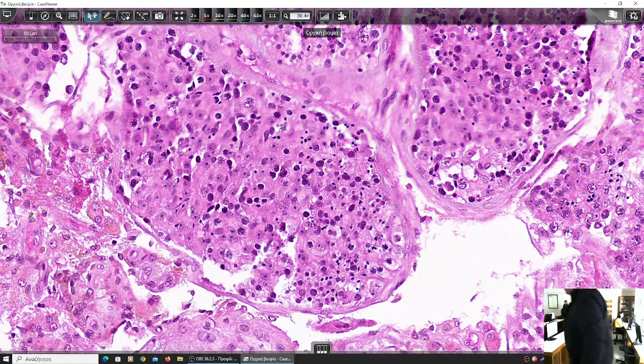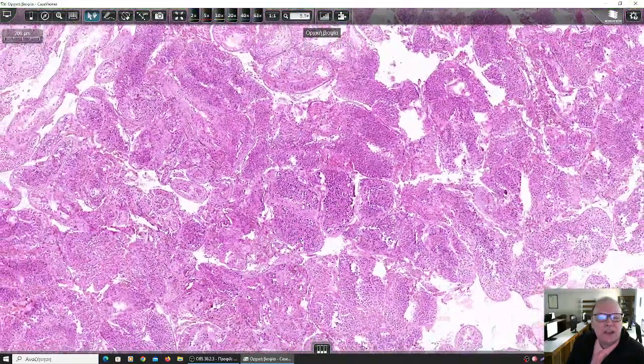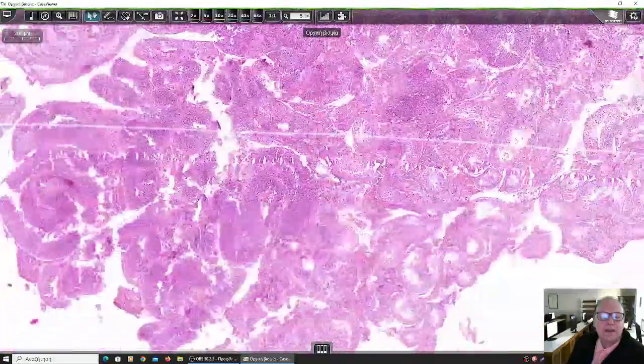Can you identify the germ cells as they mature? Can you tell me which are the ones that are very close to the basement membrane? These are the more immature cells. They are, name, spermatogonia. All right? So let's try and find another one when we have the levels of maturation more distinct, because here they are mixed. It's not a good tubule to study.